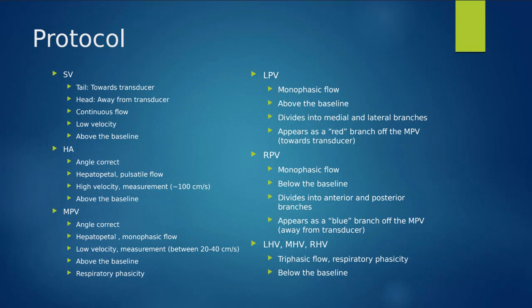This is the only artery that we are Dopplering, so it is going to appear very pulsatile, like most arteries do. We have to make sure we are using angle correct for any artery in the body. That's where we make sure that our gate has that angulation on it.